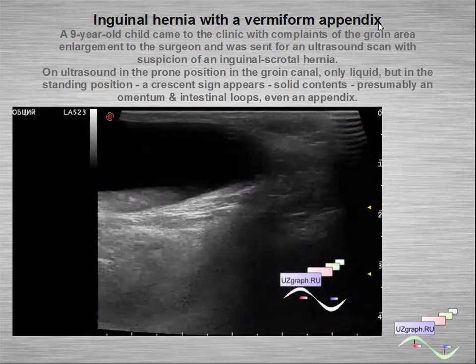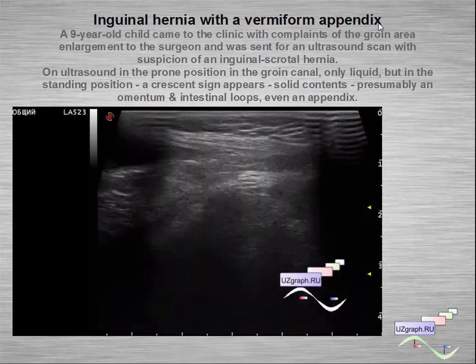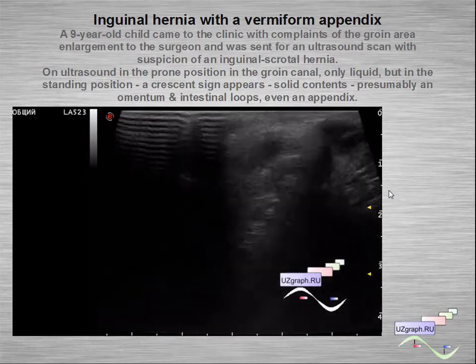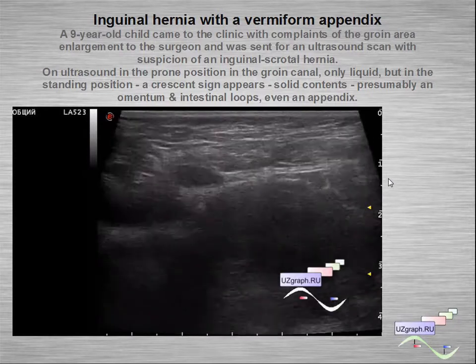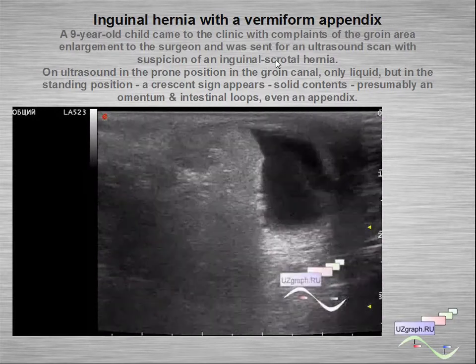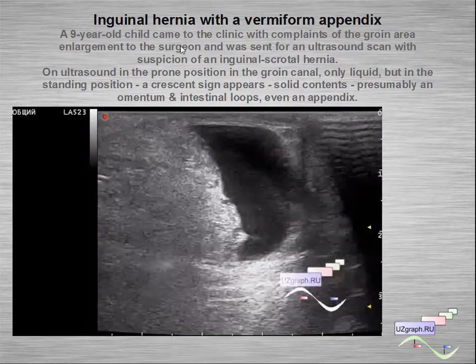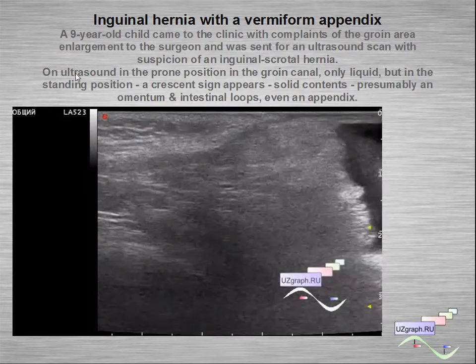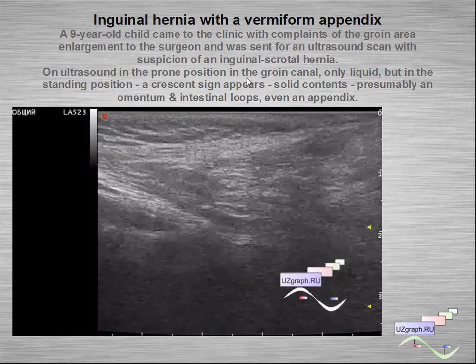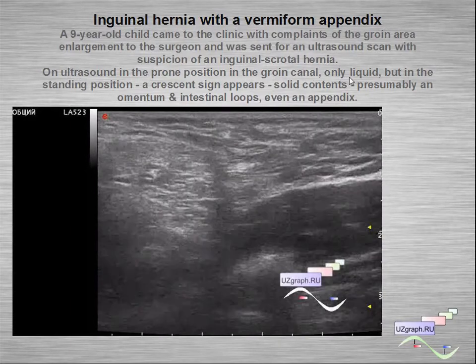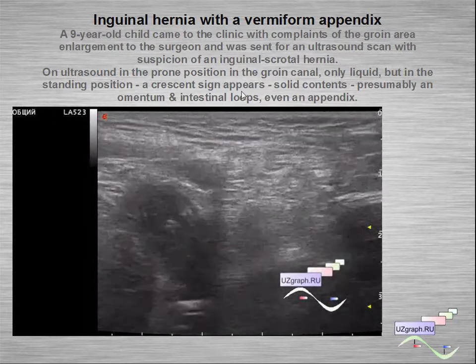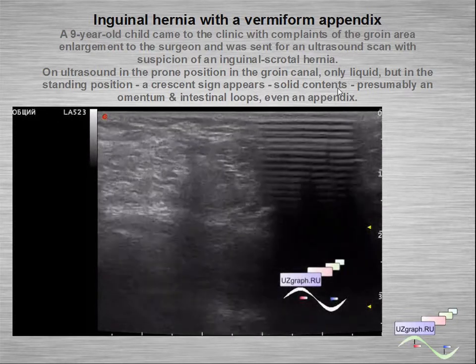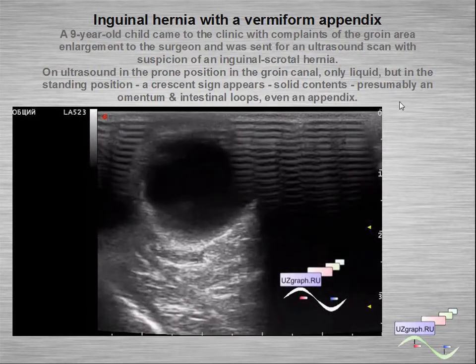Another example of inguinal hernia with a vermiform appendix: a young child came to a clinic with complaints of groin area enlargement and was sent for ultrasound after a surgeon consultation with suspicion of inguinal-scrotal hernia. On ultrasound in the supine position in the groin there is only fluid, but in the standing position we can see a crescent sign — solid content, presumably omentum, and even the appendix.